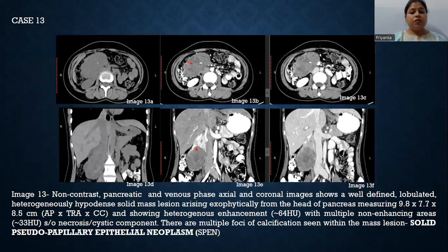Case 13 demonstrates a solid pseudo-papillary epithelial neoplasm (SPEN). There is a well-defined, lobulated, heterogeneously hypodense solid mass lesion arising exophytically from the head of the pancreas, showing heterogeneous enhancement with multiple non-enhancing areas suggestive of necrosis or cystic component. There are multiple foci of calcification seen within the lesion.